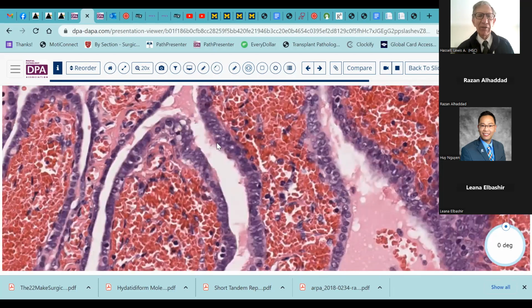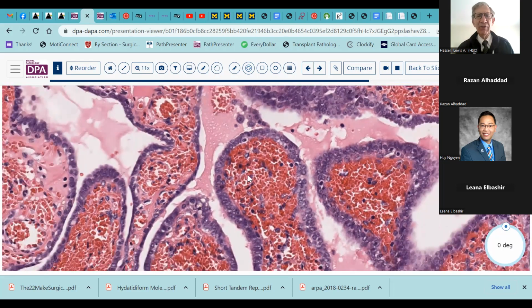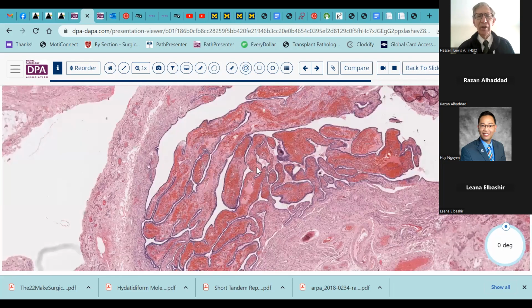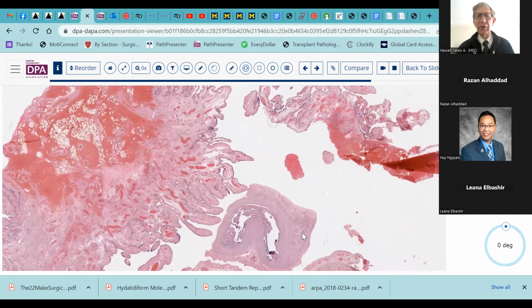So just a very subtle difference, as you can see here in a few areas, and not a widespread thing. Now, if you're just dealing with a few cells, you may have difficulty controlling whether or not your immunohistochemical stain is truly going to give you the same area of question if it's a very small area. So you can have microscopic, non-detectable lesions as well that represent serous tubal intraepithelial neoplasia.